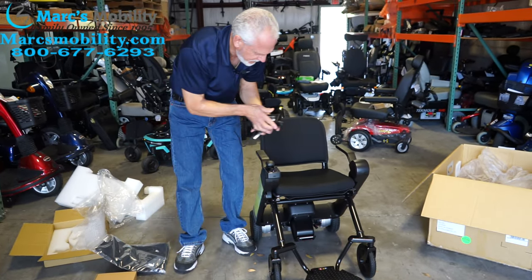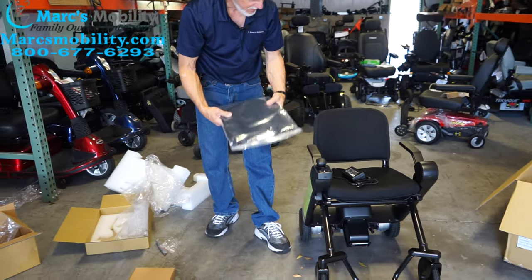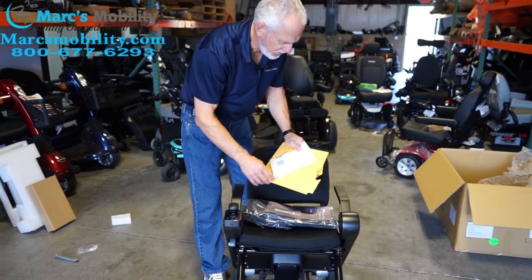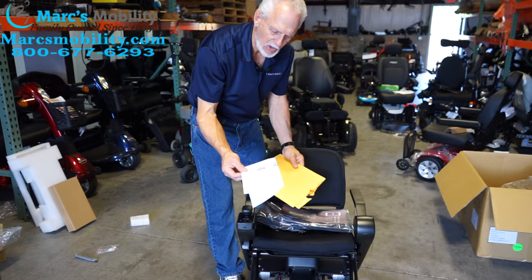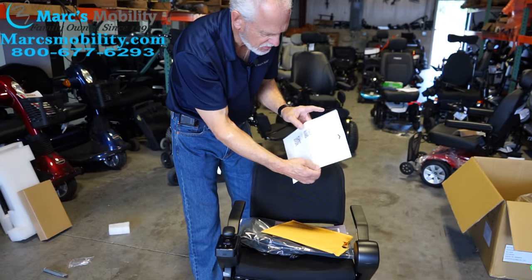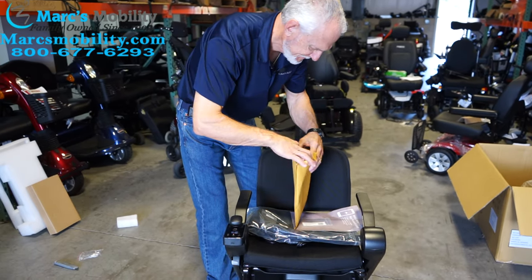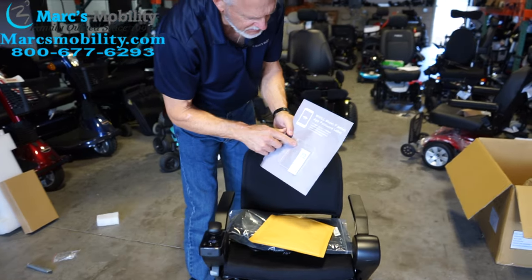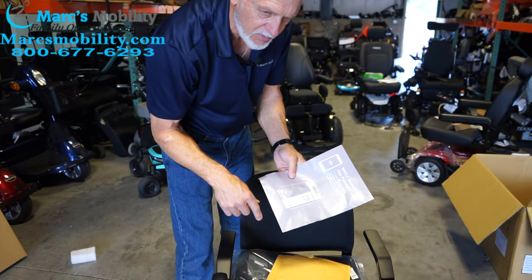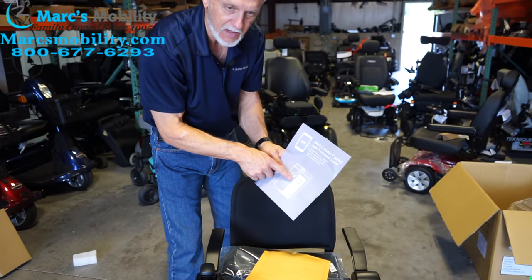We've got the charger here. This is just an extra bag that comes with the chair, and your instruction manual here. Your owner's manual you're going to have to download — this little pamphlet gives you the email and link to download your owner's manual for the chair. Also, you'll get this little brochure in your bag — don't lose this, it will be somewhere in the boxes. This is your little sticker to be able to use your phone to work with this chair. If you want to use the app for your phone, there's your code number and password code number right here.